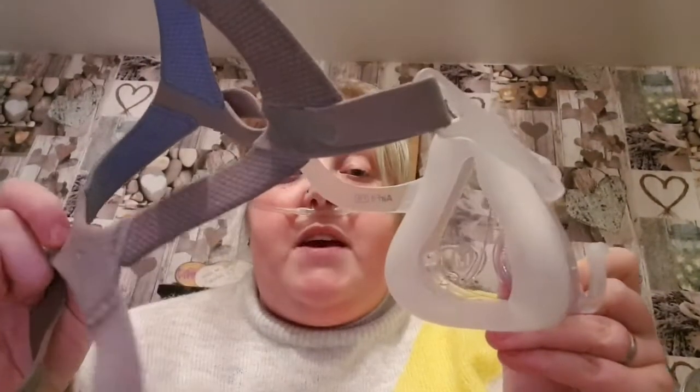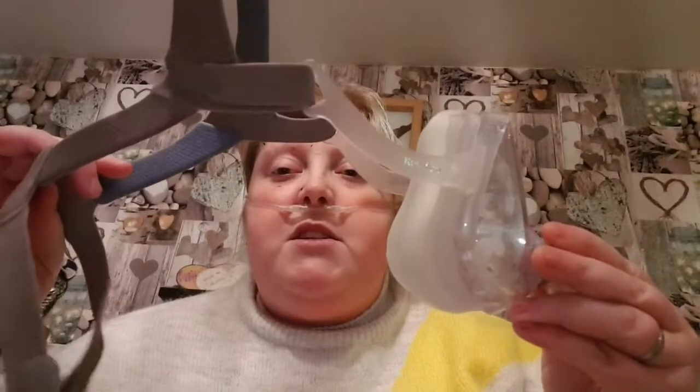The first mask I ever got given was this one, and it's the AirFit F10, and basically it's a solid mask where everything is all attached. This bit goes over the back of my head and it loops around and it hooks on like this. This is pretty rigid and it doesn't really move that far. From my first mask, I figured it was okay.